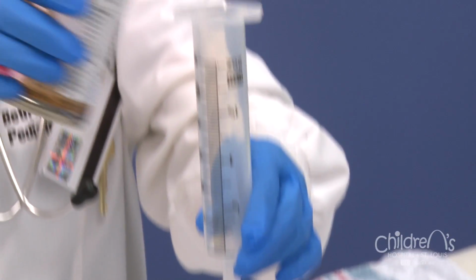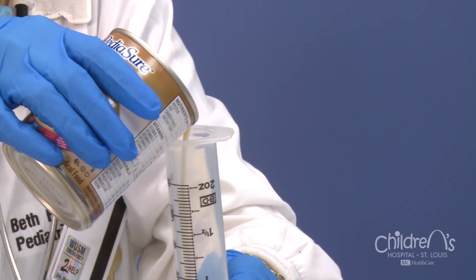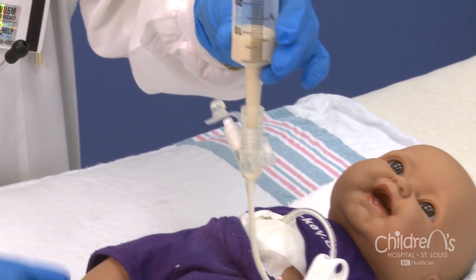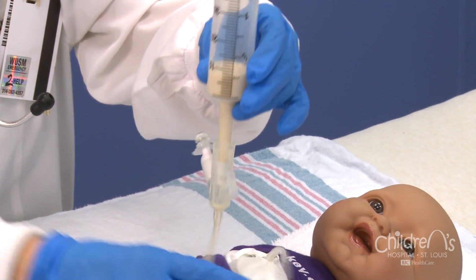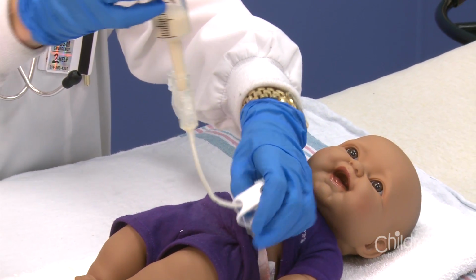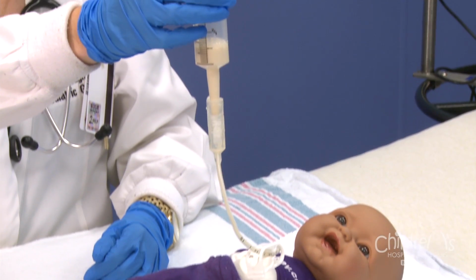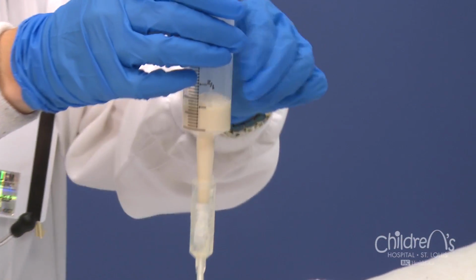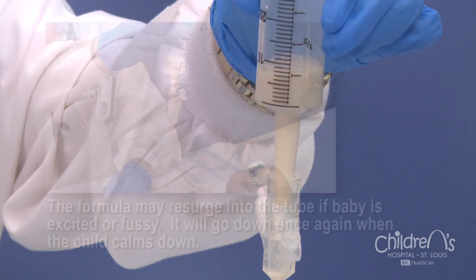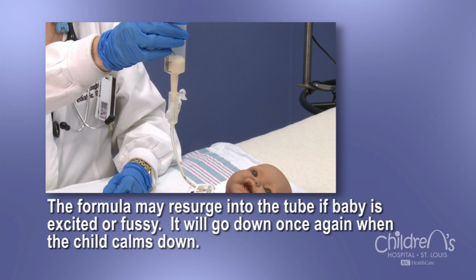Pour the formula into the syringe and hold the extension set at the level of the child's stomach. If your child's appliance has a clamp, open the clamp now. Raise the syringe until the formula flow slowly increases. If needed, lower the syringe to decrease the flow. Formula should go in over 15 to 20 minutes. The formula may come back into the syringe if the child is fussy or crying. Just wait a few minutes. The formula will go in again once the child calms down.